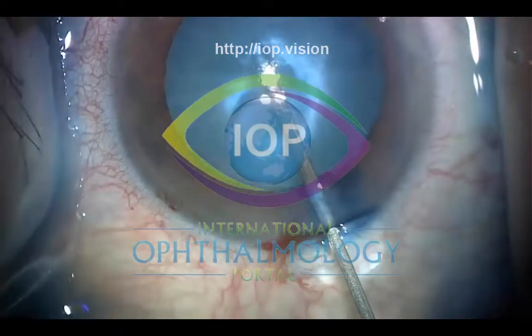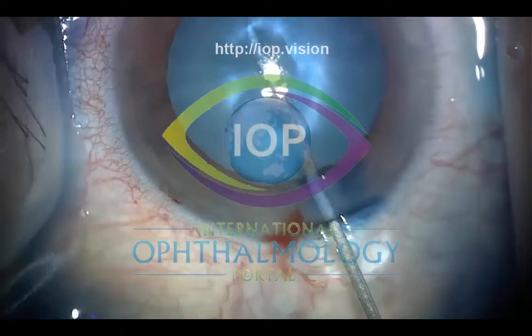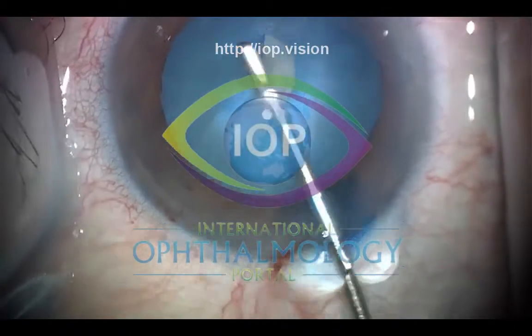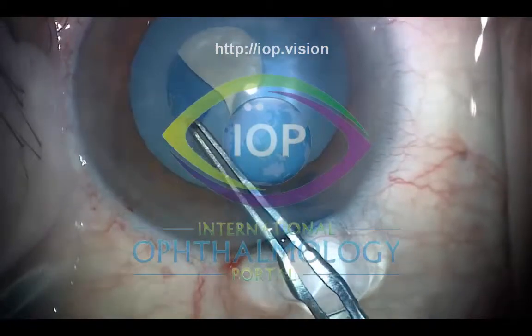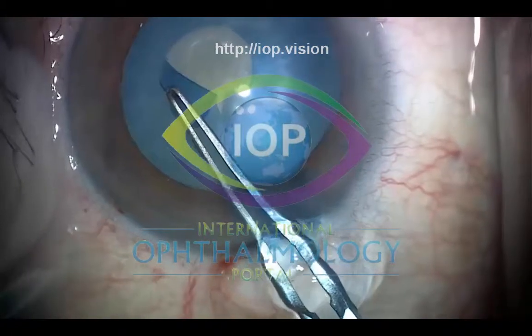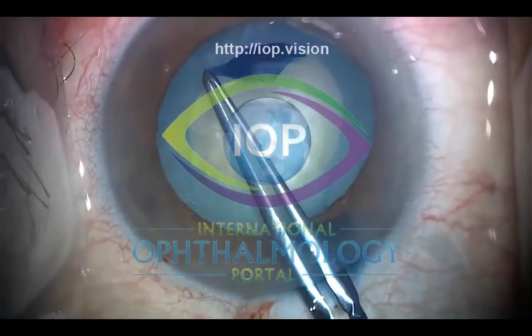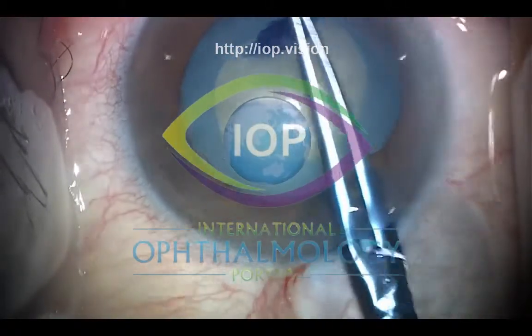This is showing my chop technique — I use a horizontal chop. We could talk about the rhexis a bit more, because it's been controlled beautifully in this case. With intumescent cataracts, the rhexis always wants to run out, and you want a big rhexis so you can have less stress on the zonules. I tend to start small — we discussed this before — you kind of circle out, like peeling an orange.